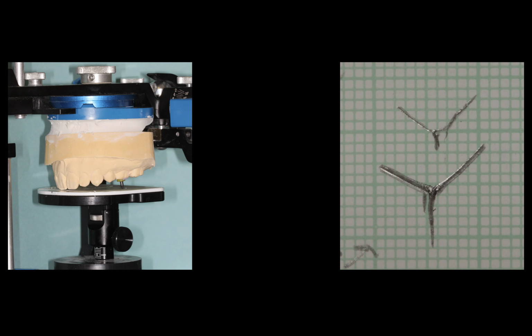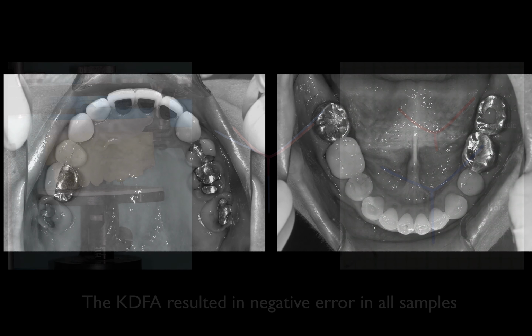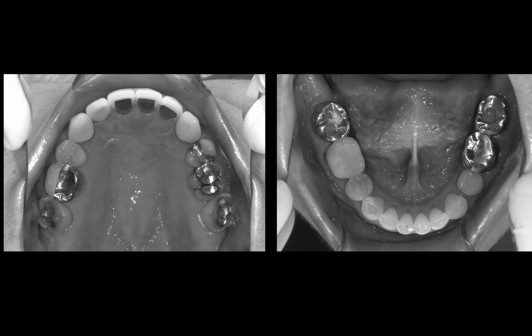Now, we then overlaid those pathway tracings with different colors, kinematic in red, Kois in blue. The interesting thing is when you overlay them, note something. Again, the angle between working and non-working pathways is more obtuse with the Kois mounting. It has created a little bit of negative error. And we found that the Kois dental facial analyzer resulted in negative error in all the samples that we reviewed. So when we utilize tools, we not only have to have an endpoint in mind, we have to understand what they do and don't do for us.